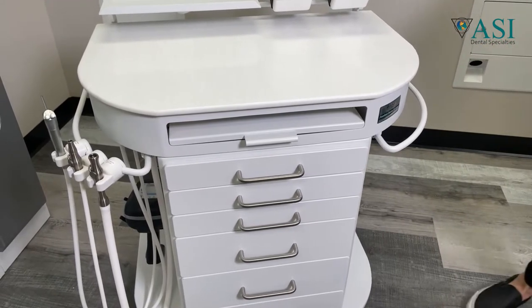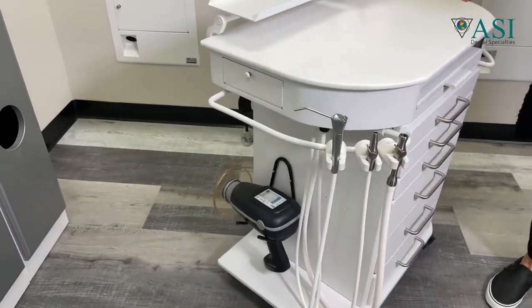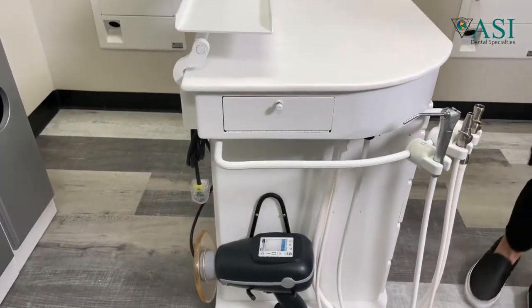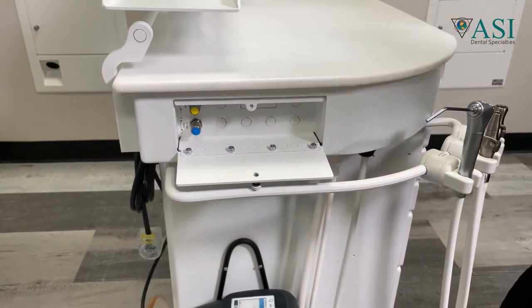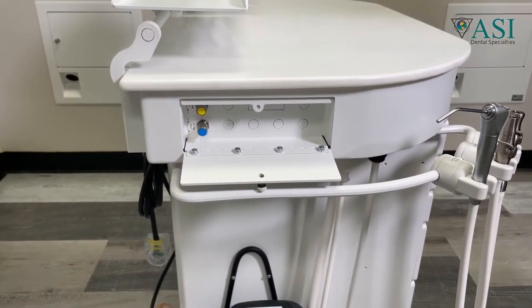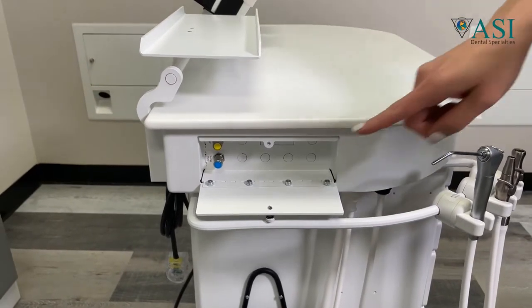We concealed the controls because we wanted to make it a patient-friendly system and eliminate the clinical look of the unit. Open the door and there are your flow controls for your air and water syringe. If you wanted to add instruments that also operated off the unit, those controls would be contained in here as well.